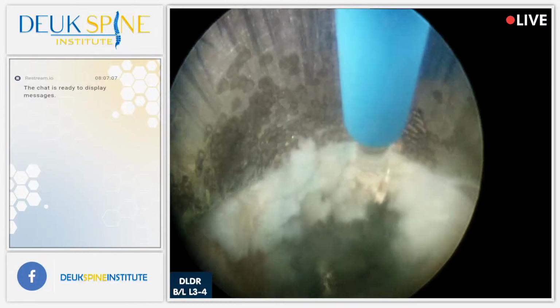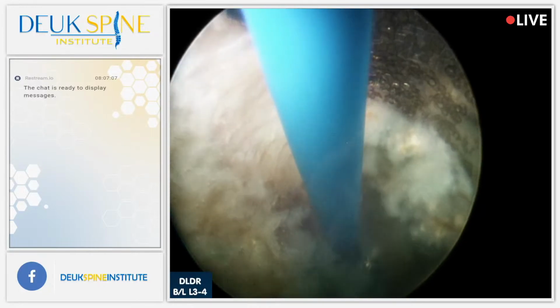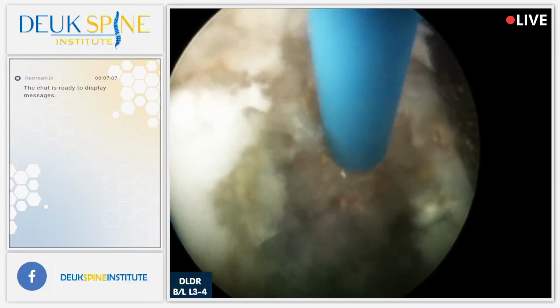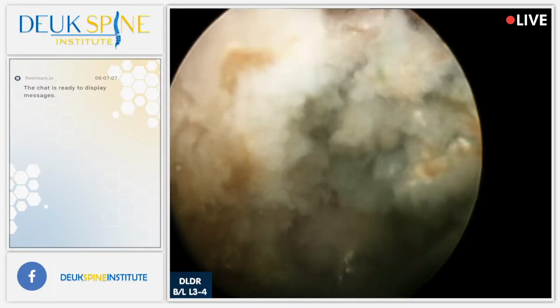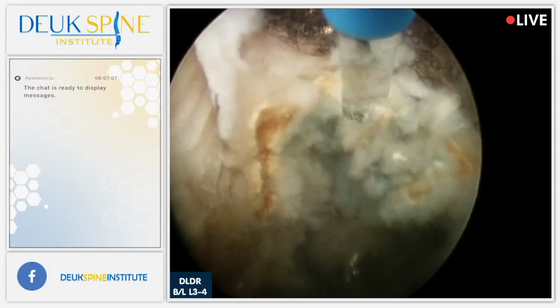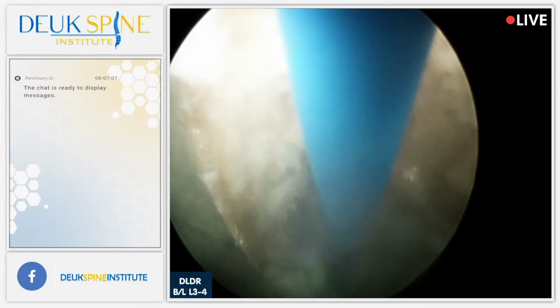So long story short, what I'm getting at is that there's a lot of details that go on in this surgery that I talk about some of them when I can, but there's things that also pop up when there's a problem and then we realize the details aren't right. For example, if the irrigation isn't cold, it's very important because the laser will get hot and it literally can burn tissue if you don't have it submerged in cool liquid.